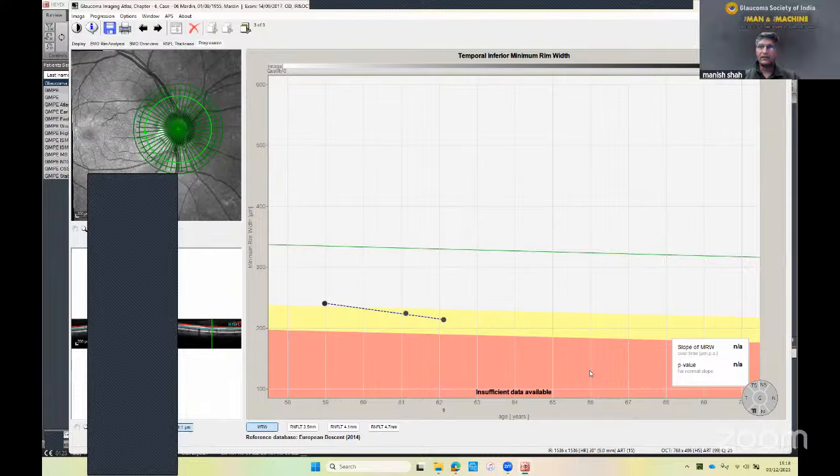I had one question, Martin. Regarding the image quality, the data doesn't seem to be very reliable once the image quality drops. So how do you factor in, or where do you look for, the image quality? What is acceptable image quality, and what is not?